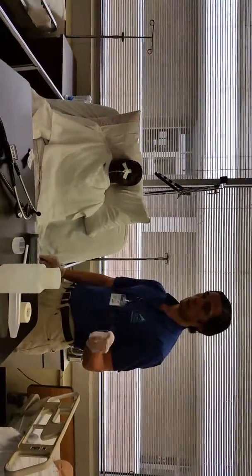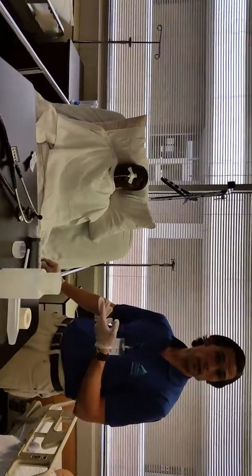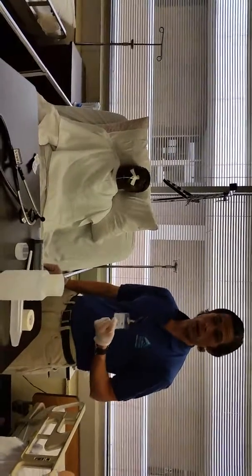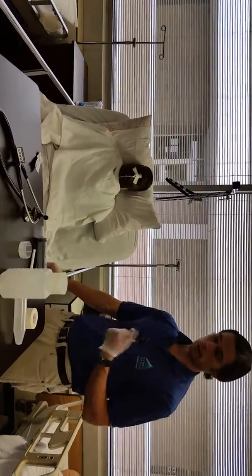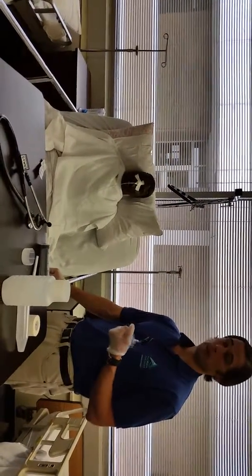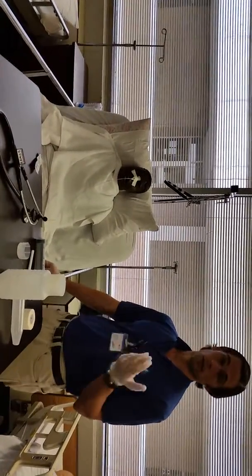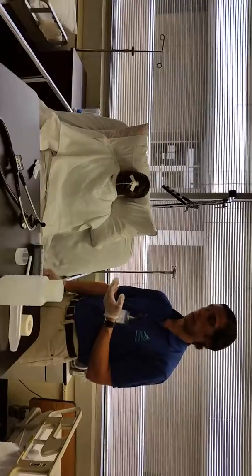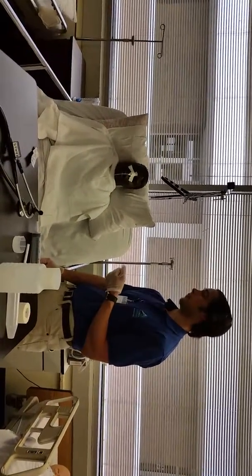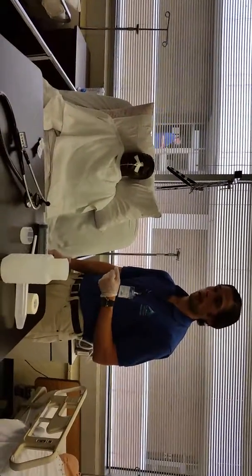I would walk out of the room and document everything that happened, the type and amount of solution that I irrigated with, the volume difference from the input that I gave and what I drew out, what the characteristics of the fluid were that I withdrew or aspirated, if it were difficult or easy to irrigate, and then the client's response and the teaching that I would have given them about not pulling out the NG tube. If they have any problems, to hit the call button and let me know. And that is it.